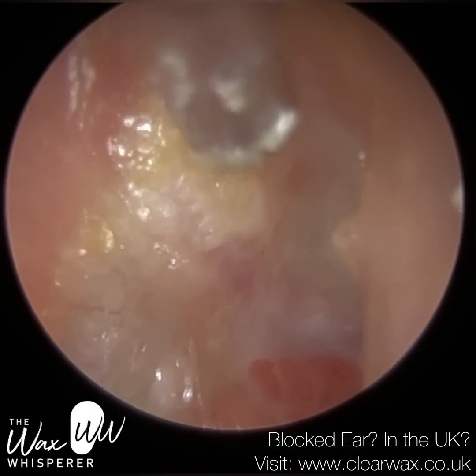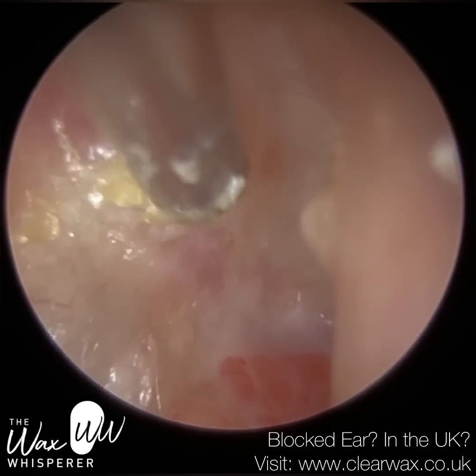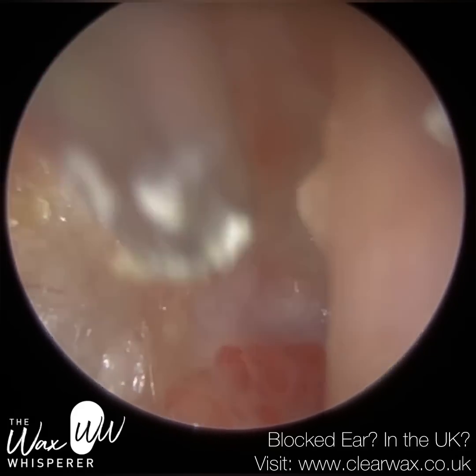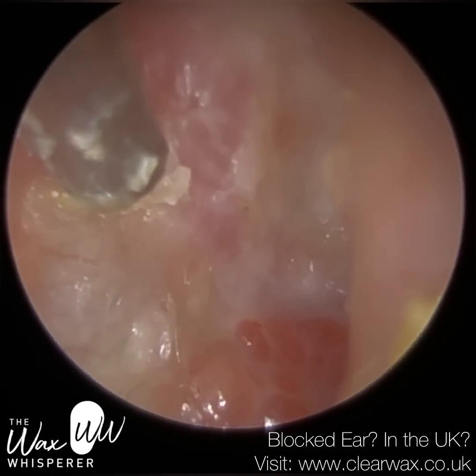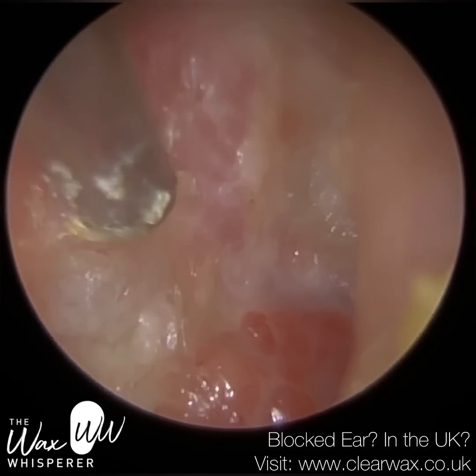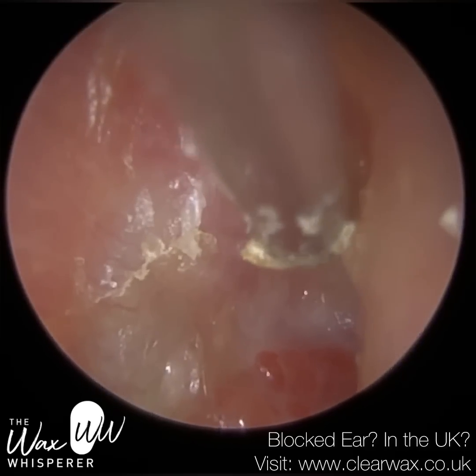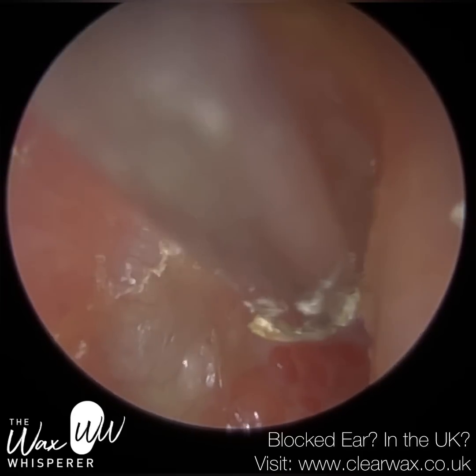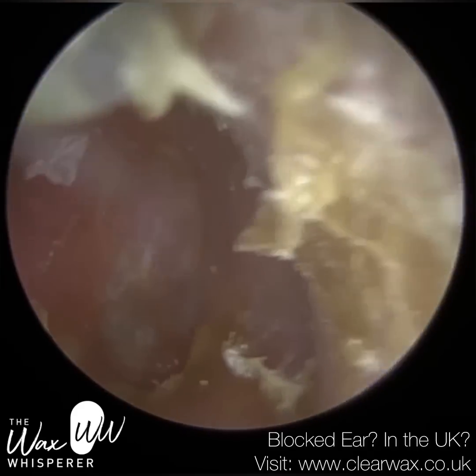And there's just some damp, dead skin on the posterior superior quadrant, so northwest part of the ear canal. I'm just trying to, again, peel downwards. I don't want to extend the suction probe any further. I don't want to dig into the eardrum. I want to come away and down, so gliding downwards to make minimal contact. I think I'm going to be able to get more. I'm really, really pleased with that. I think there's another bit of skin just there. So in terms of the eardrum, I'm very pleased with that.